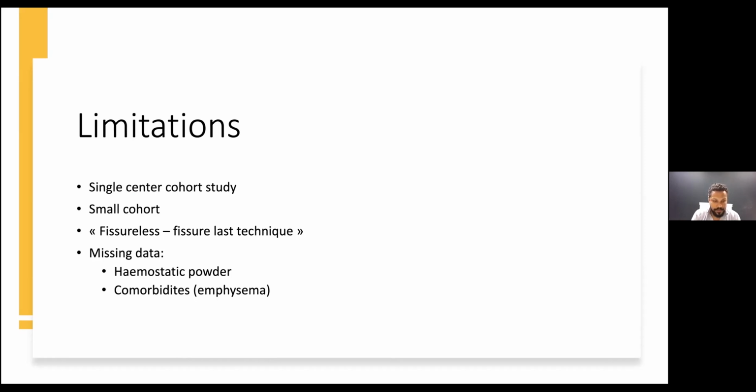And I already told you there are important missing data, in particular on hemostatic powder, but it's an ongoing study, and we are trying to collect this data retrospectively, along with a few more comorbidities which could probably have impacted not only the air leak, but the length of stay, particularly emphysema, things like that.